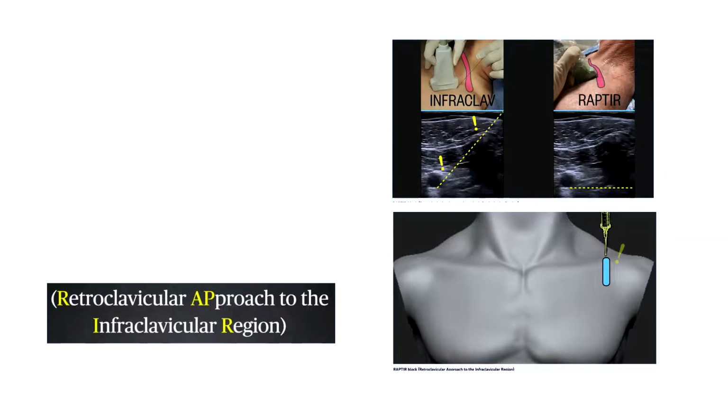The problem with that approach is that it ignores that the suprascapular nerve crosses there. It has now been acknowledged in the literature that suprascapular nerve damage is possible with this technique. You will encounter the suprascapular nerve behind the clavicle, in the area where you're not seeing the needle.